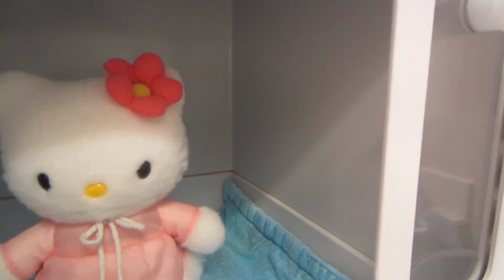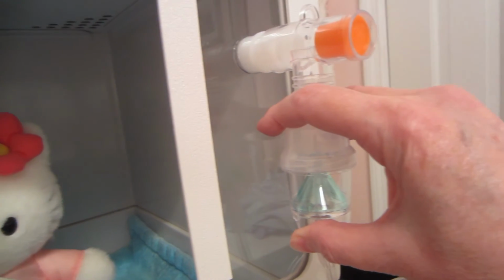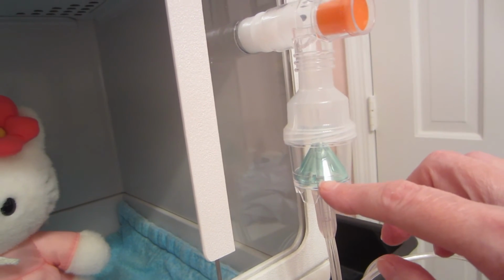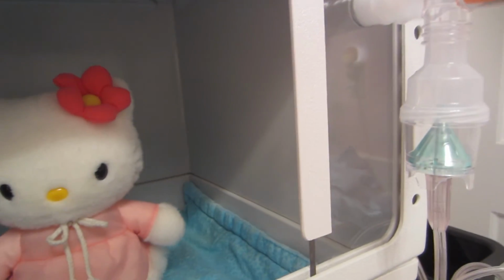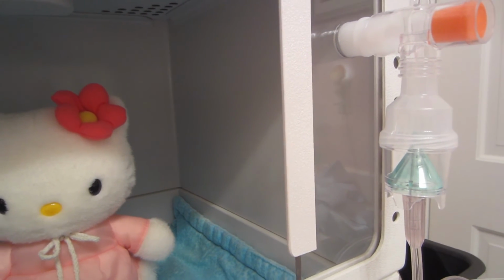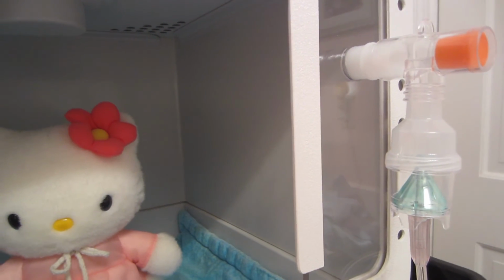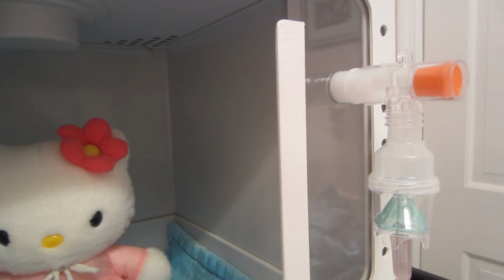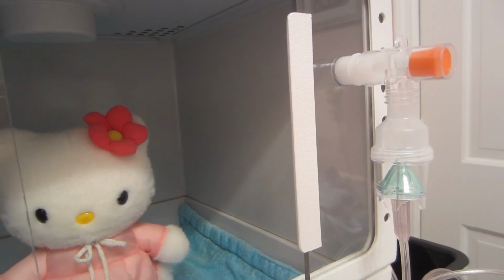Now you may only get 20 minutes or 25 minutes worth of actual nebulizing of the medication. That's fine. If you run out of medication in your nebulizer, just go ahead and turn off the compressor and let the cat sit in the chamber for an additional 10 minutes so that you get a full 30 minutes of treatment. I've read in several places that that is really, really important, to get a full 30 minutes of the medication inhaled into the lungs and into all the sinuses and all that good stuff. And really it takes longer than that, but 30 minutes is fine.